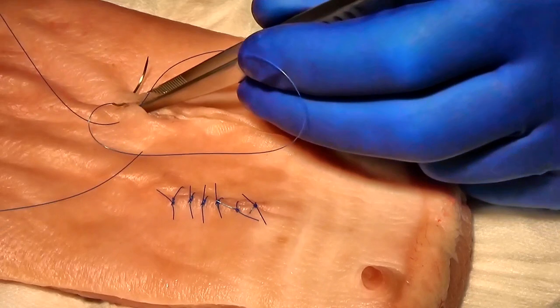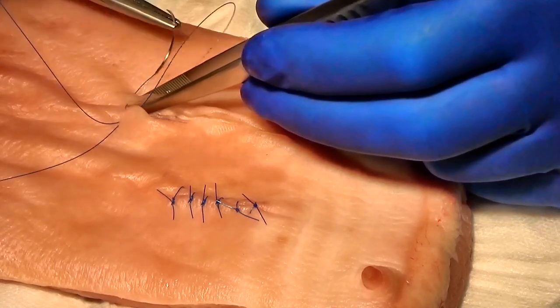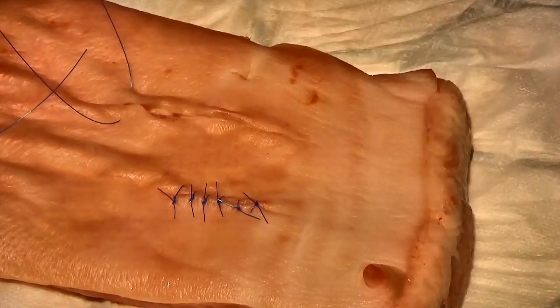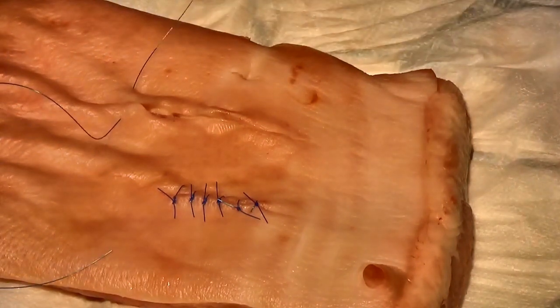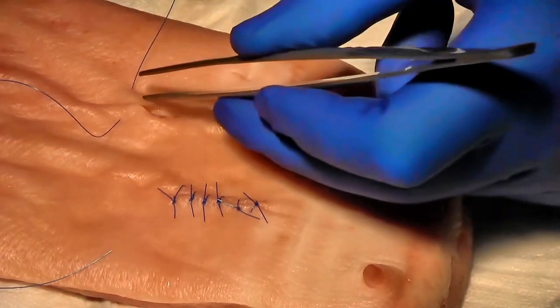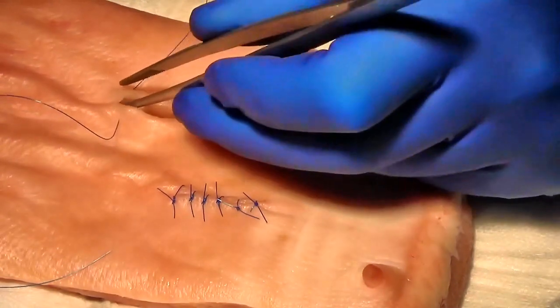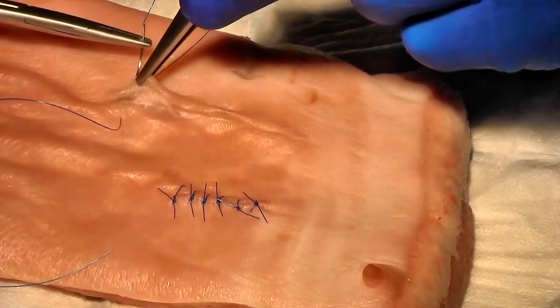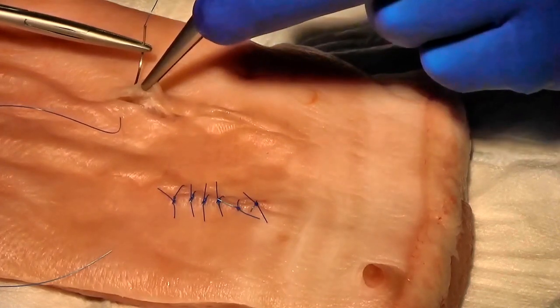And I'm now going to mount the needle backhand, that is to say, bring it through the skin in the opposite direction. You go through the skin very close to the edge of the wound, bring it out between the dermis and the epidermis.